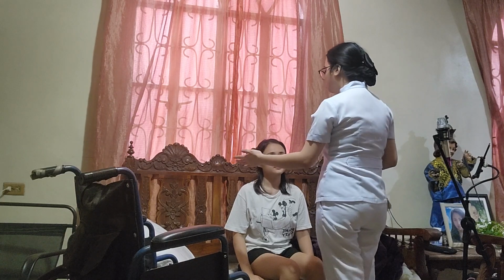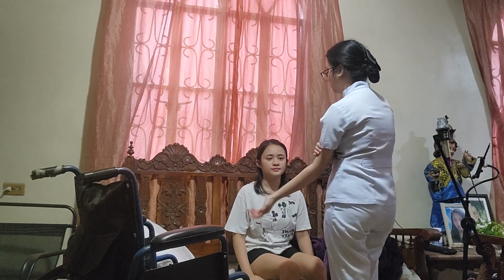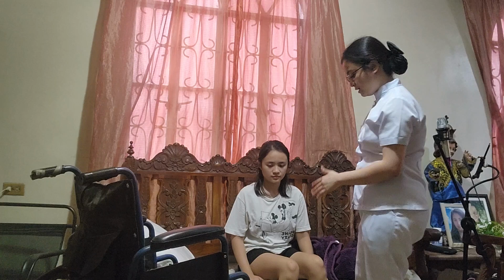So ma'am, nung in-assist ko po kayo sa pag-upo, nalilo po ba kayo? Hindi naman po. Okay, that's good po. Then after that, of course, you will let the patient sit for a minute so that her circulatory system will adjust because of the change of position. Then I will put the patient's slippers on for comfort.